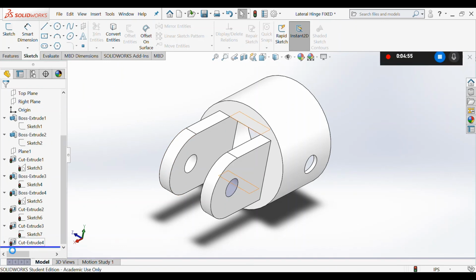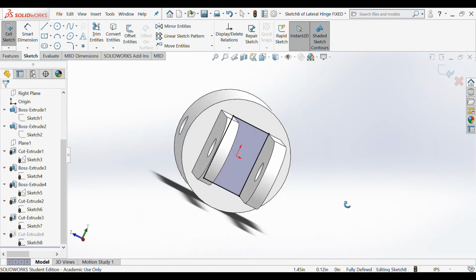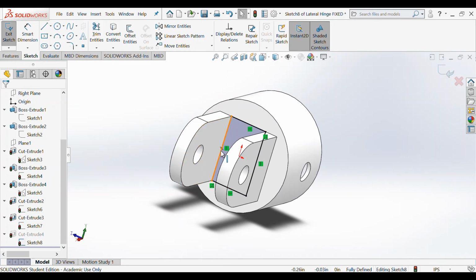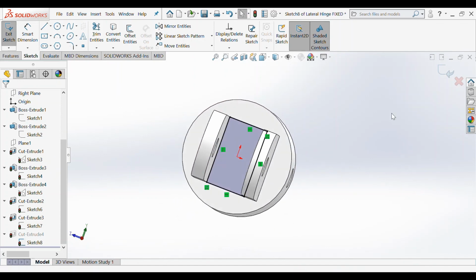Last but not least, we're going to create one more sketch. This sketch will be a rectangular entity between these two pieces. So you're going to convert entities. You're going to convert this edge and this edge. And then we are going to sketch, and we're going to draw a line from here to here and from here to here. This will define our sketch fully.